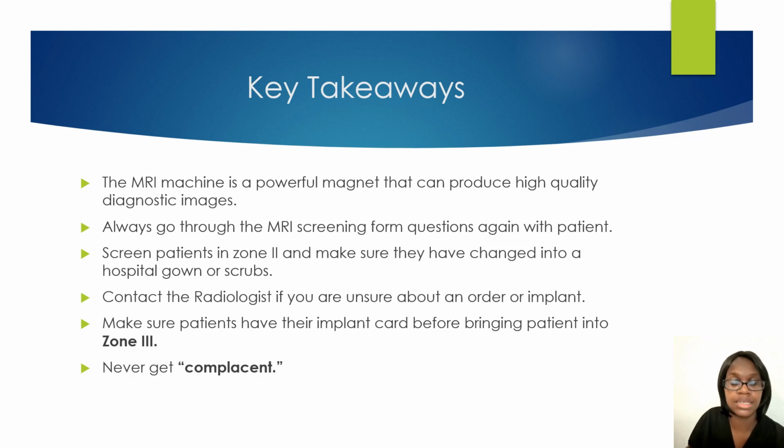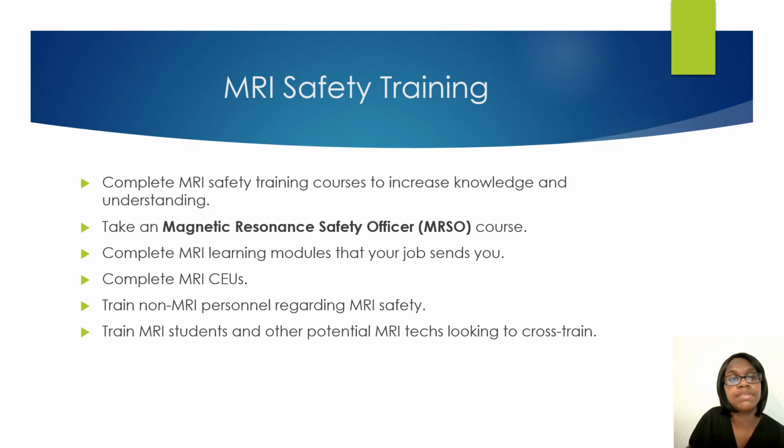Never get complacent. For MRI safety training, complete the MRI safety training course to increase your knowledge and understanding. You can also take an MRSO course, complete MRI learning modules that your job sends you, complete your MRI CEUs. You want to train non-MRI personnel regarding MRI safety. Also train MRI students and other potential MRI techs that are looking to cross-train into MRI.